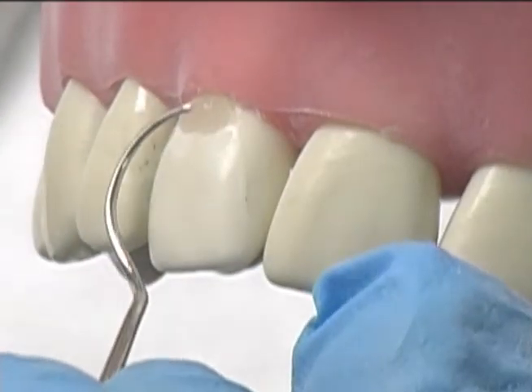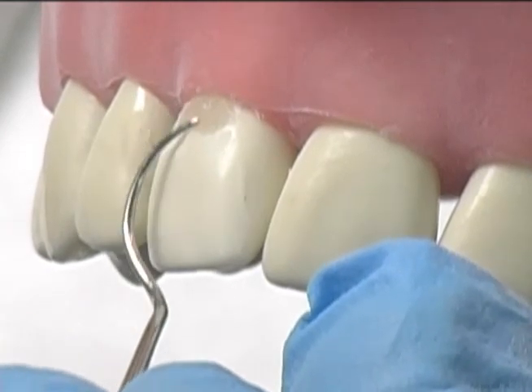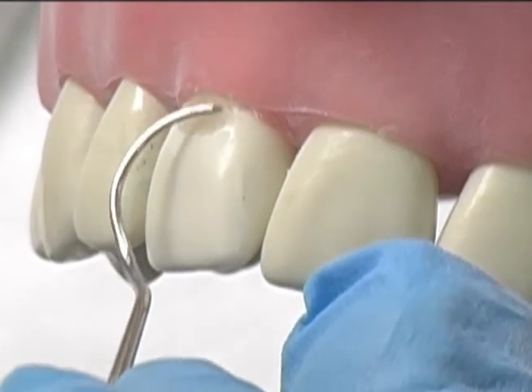And recheck the margin. We have smooth margins, and this completes the class 5 on the facial of number 8.